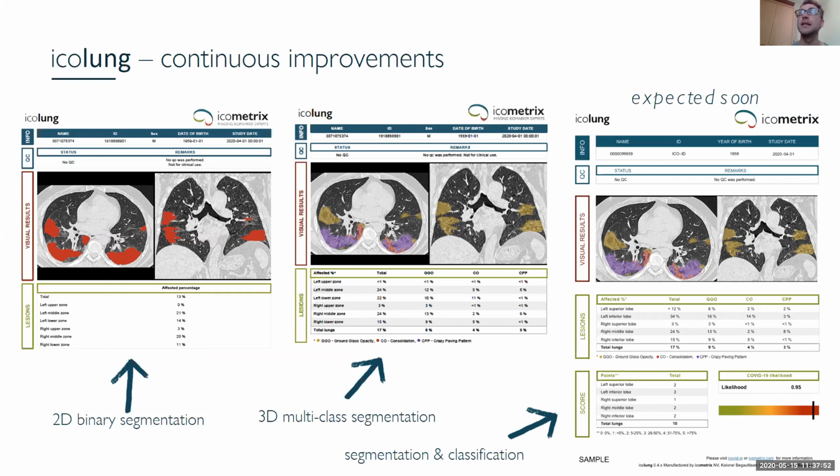And as put in the final conclusion slide of Professor De Mey, this is an important help, especially in the future when the number of COVID patients will likely decrease further. And it's important to detect them early on when they are coming into the hospital and are being scanned under CT scan in this case.